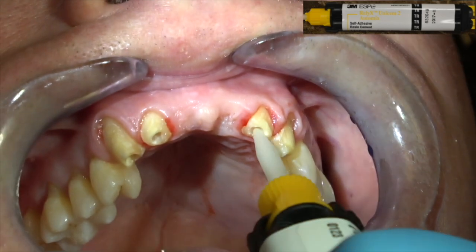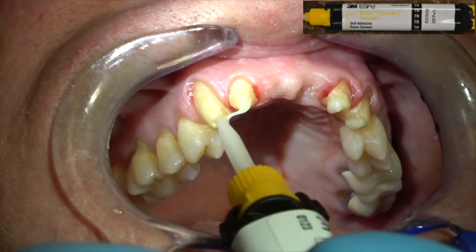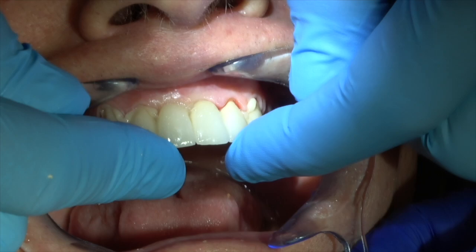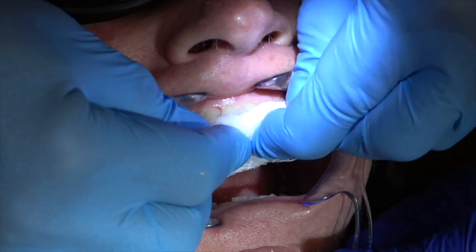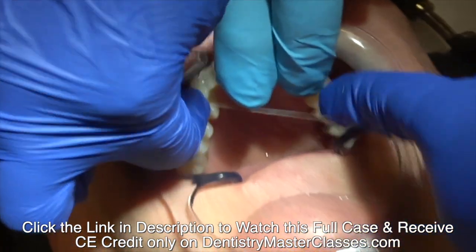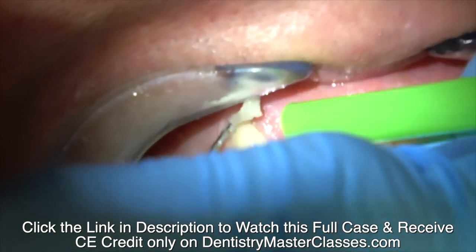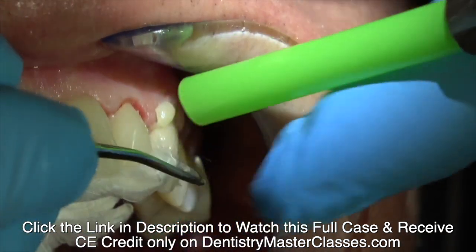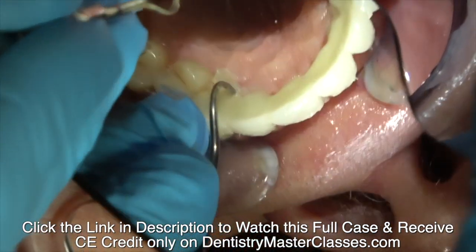Put firm pressure until the cement sets initially. You want it to peel off — you don't want it to wipe off. If it wipes off in the flowable state, you'll get a void in the micro gap between the retainer and the tooth. It'll pull the cement out. So you want it to peel off, not wipe off. I want it kind of like crunchy snow — just peel off. Then you fill that micro gap between the retainer and the tooth.